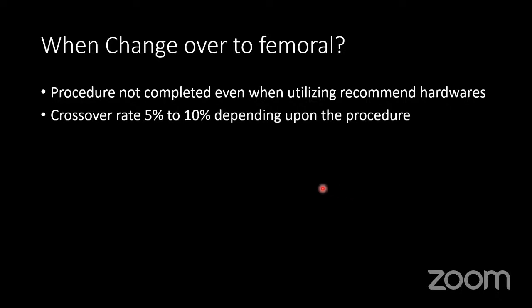And when to change over to femoral: when the procedure is not completed even when utilizing recommended hardware. The crossover rate is 5 to 10%. Whatever the experience, it will be around 1 to 5%, and for a beginner it will be around 10%.